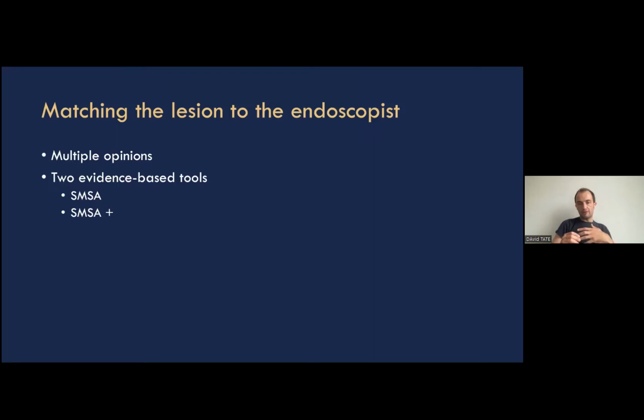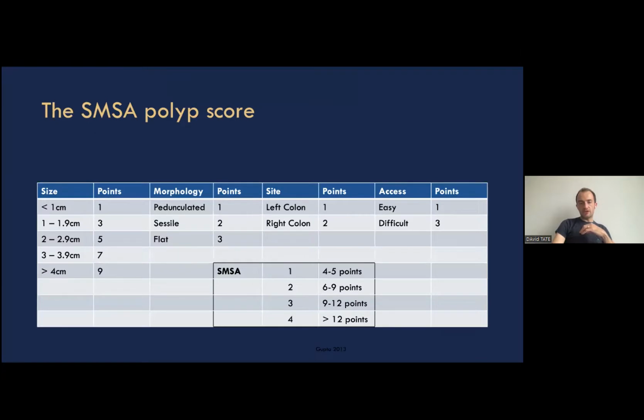For cancer. But the question about the endoscopist is not well covered by what I've just told you. I've just told you a whole load of ways, focused on a demarcated area and some other characteristics of polyps which increase their chances of cancer, to decide whether a polyp has cancer. But I haven't told you how to decide whether to do a polypectomy based upon your competency or the perceived difficulty of the polypectomy. So there are two tools which can be used to somewhat objectively assess how difficult a polyp will be to remove.